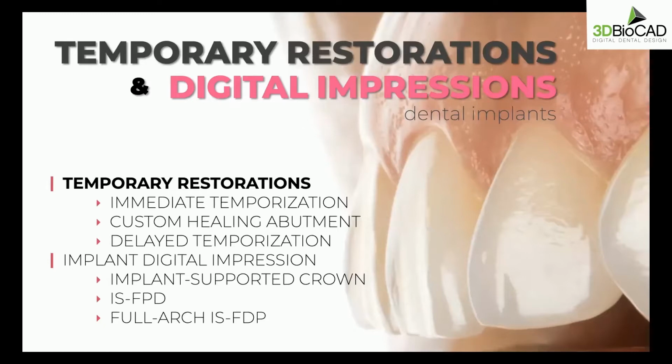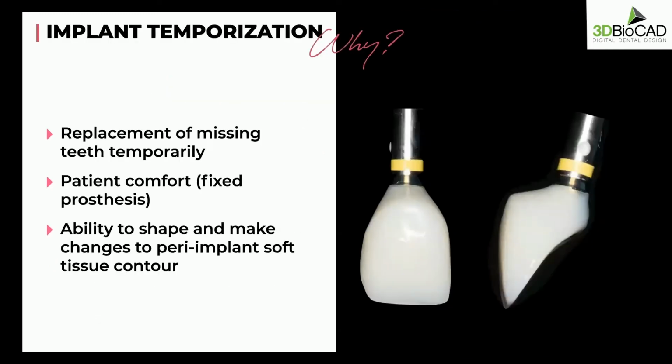So let's start with temporary restorations and why do we do them? One of the obvious reasons is to replace missing teeth temporarily and also for patient comfort, because compared to an interim partial denture or an essix appliance, because it's a fixed restoration, it's much more comfortable for the patient.